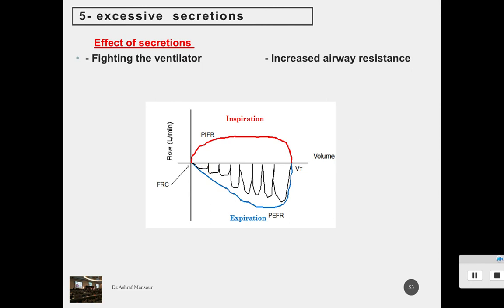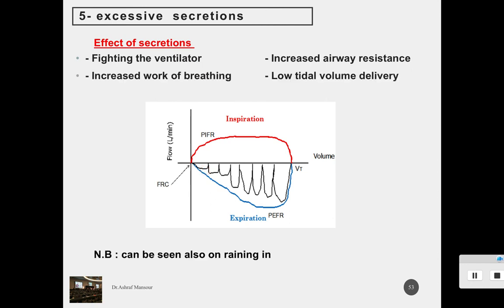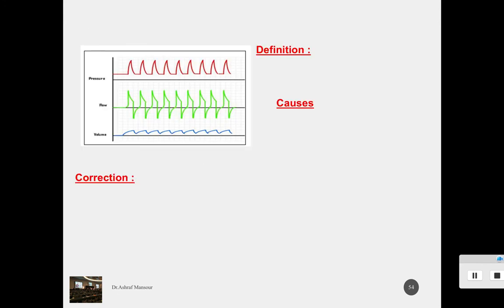So the effect of secretion, as we said, and don't forget rain-in from fluid due to condensation. What is that one? Very rapid rate, reaching 100-120 per minute.